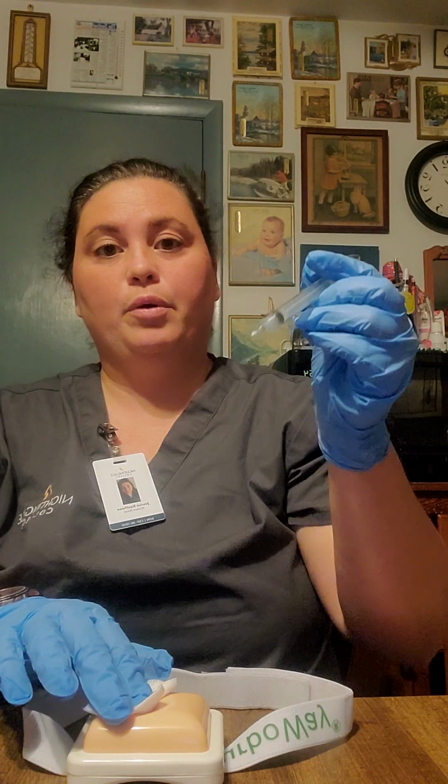Alright, I would get my gauze here, and I'm going to pull it out. Dispose of this straight into my sharps container. I'm going to hold a little bit of pressure here for a couple seconds, and I would check to see if my patient was bleeding. I then would put a Band-Aid on, but since my patient is not bleeding, we do not need a Band-Aid.